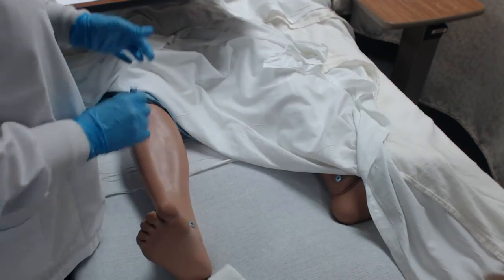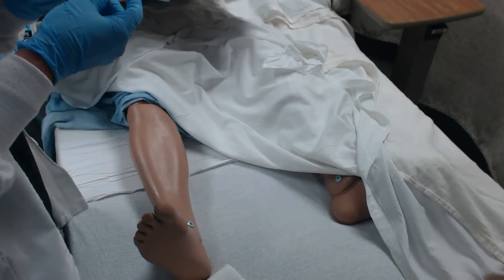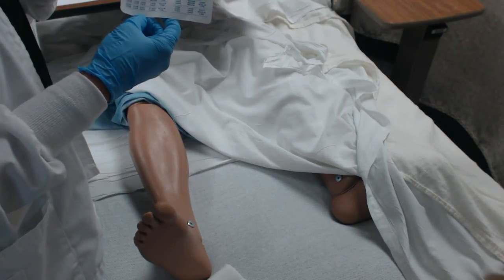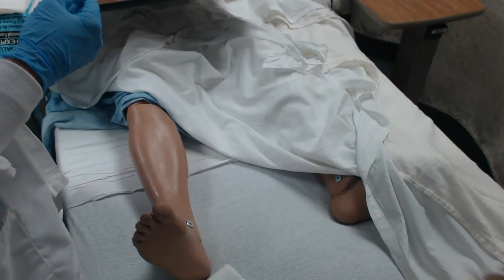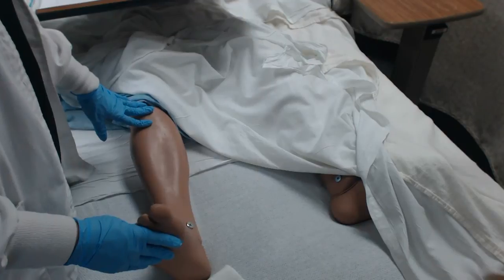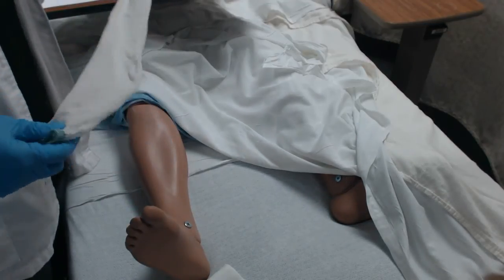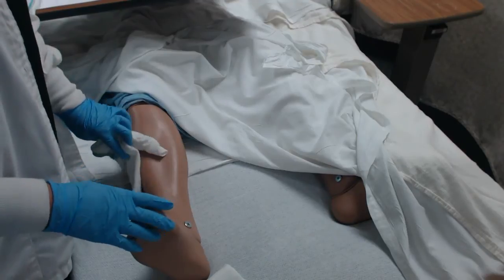On the chart, you're going to have size, so small, medium, large, or extra large. And then you're going to have length, so regular or long. You need to know that information because not everybody is the same size. You need to measure first, and we've completed that, and then we're going to go over and get the appropriate package that fits the patient.